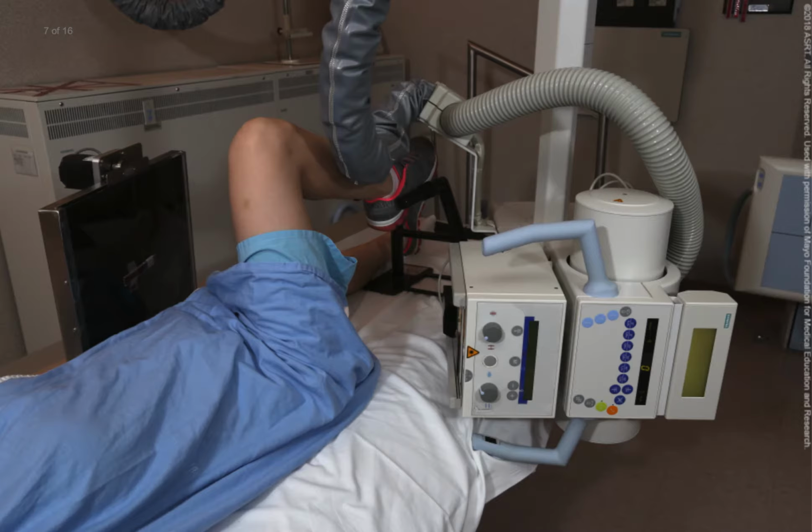Make sure the patient's pelvis is not rotated. Unless contraindicated, rotate the affected leg and foot approximately 15 to 20 degrees medially to position the femoral neck parallel with the plane of the table. If needed, place a cushion under the knee and a sandbag over the ankle to help the patient maintain the correct position. A physician should manipulate the affected leg if a patient has an unhealed fracture.